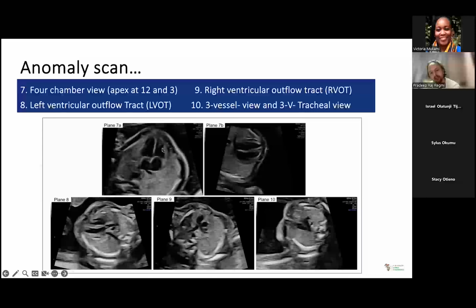And this is the four chamber heart we see, and in different planes we see the heart. And this fetal echo is one of the common things we do in our regular practice, and it is also one of the aspects where artificial intelligence can play a role to detect fetal congenital cardiac anomalies in the fetal heart.